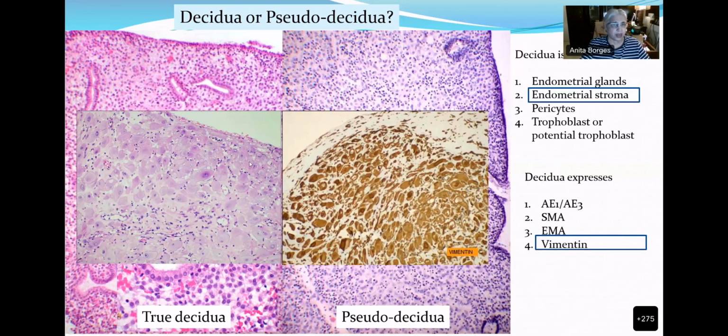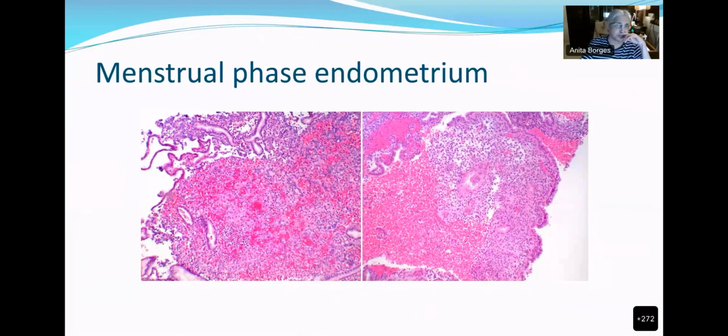And you see this. This is well-developed decidua. It's huge. It's boxy. The cells are huge. It is box-like. Okay, and often you see some lymphocytes and NK cells in this decidua. They're in all decidua, and this is vimentin. And you see the vimentin very strongly expressed over there. And you shouldn't get cytokeratin or EMA or SMA. Very good.